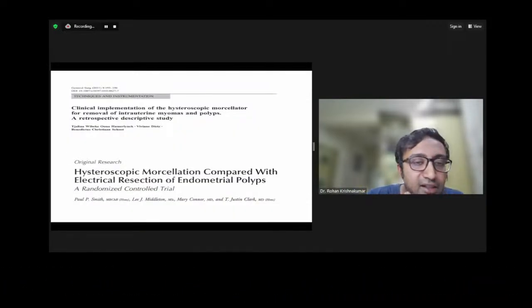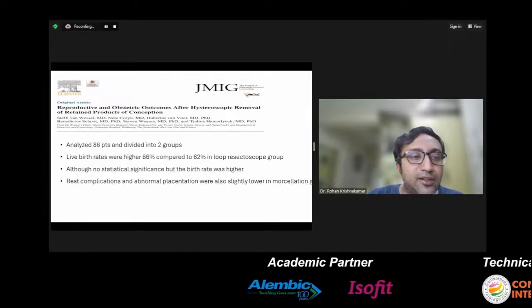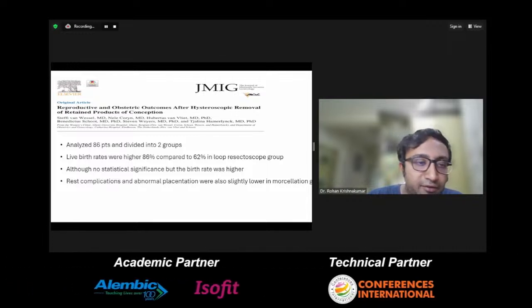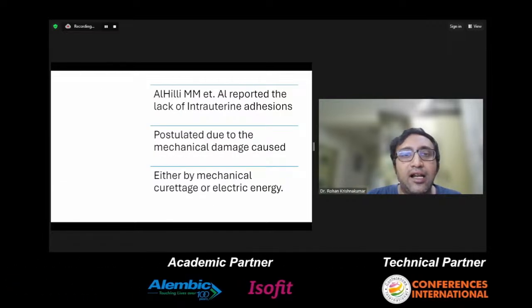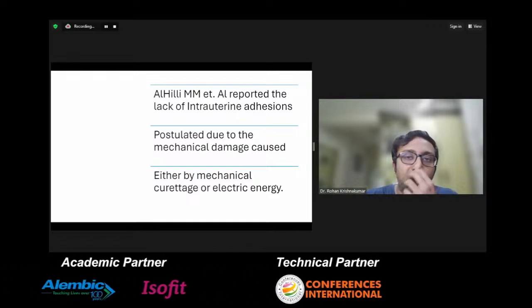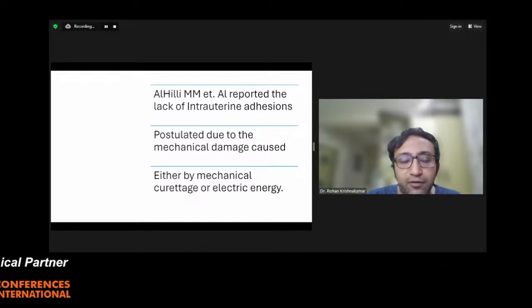There are many studies here showing that morcellators are better compared to electrical resections for polyps as well as myomas. They've analyzed patients and found more live birth rates in which morcellators were used compared to resectoscope. This is probably because of the less damage to the endometrium. Al-Healy also reported lack of intrauterine adhesions because of less mechanical damage, because of less use of curettage and electrical energy.